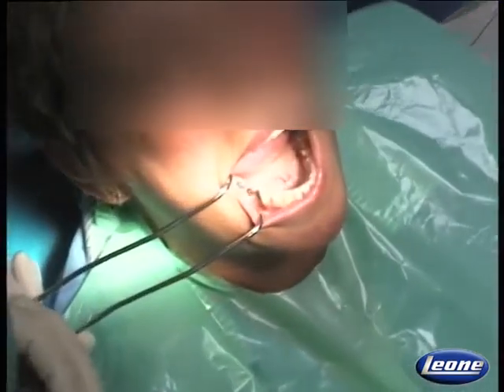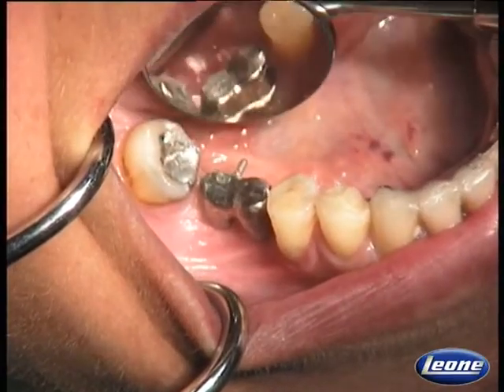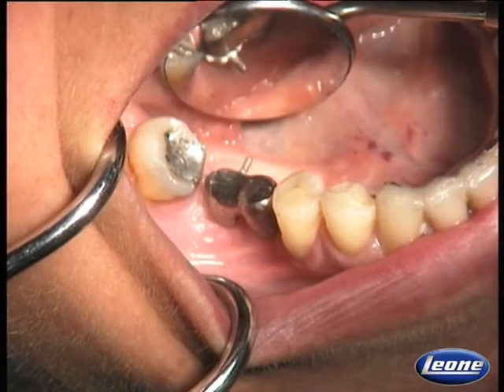Now we can try in our metal framework. If it fits perfectly, like it does in this case, and it fits passively and goes completely down to the margins of the abutment.